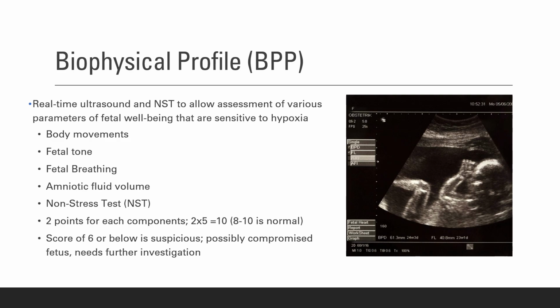I used to work in the high-risk maternal fetal medicine clinic, specifically in the NST clinic. It's an extra certification to get your OB limited ultrasound certification. So as an NST nurse, I also did this with patients in the past. Basically, we're doing a biophysical profile. We're taking an ultrasound, scanning that baby, and assessing different parameters to see if the baby is actually hypoxic.